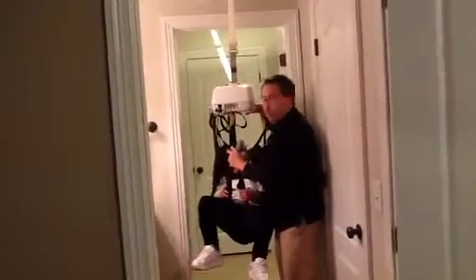I may not be able to sneak by Bree here, so what I'm going to do is pull her in front of me so I can get behind, take that strap loose, and follow it back into the lift.